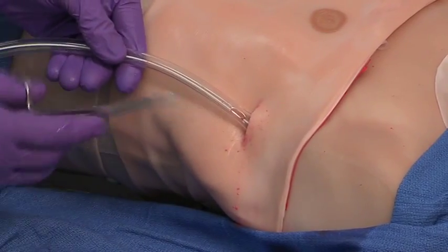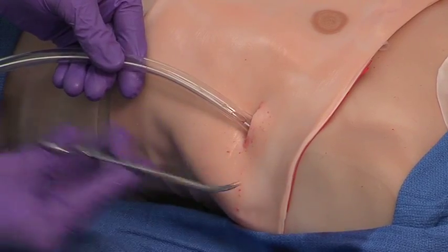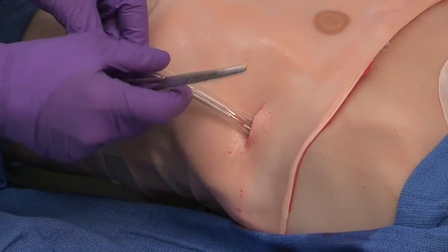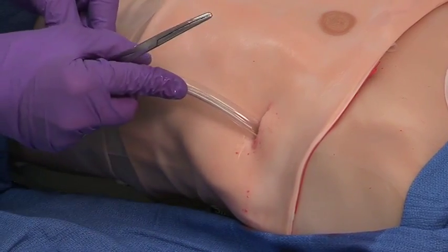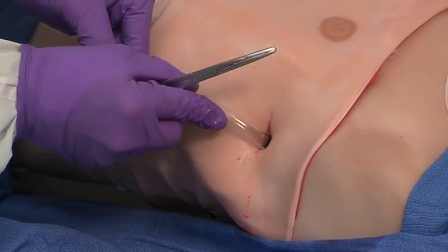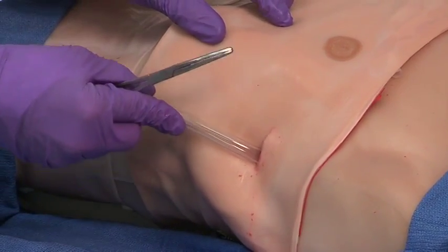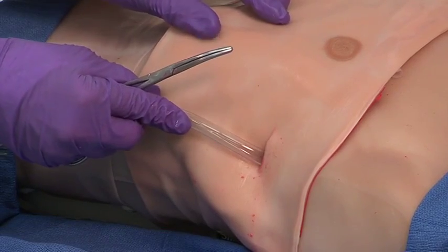There's the last hole. My goal now is to have this go in a posterior direction, laying along the back of the chest wall towards the apex. So that last hole's going into the chest, I'm advancing it, and I usually advance this till I feel a little bit of resistance. That tells me I'm bouncing off the apex, and then I pull back a slight amount, so this is 1 or 2 centimeters from the apex.